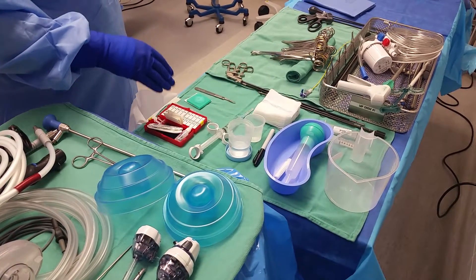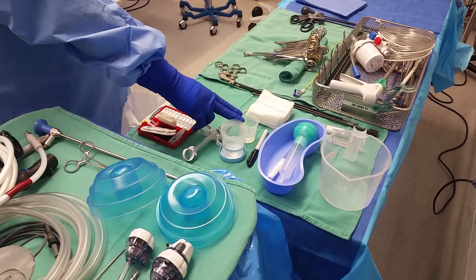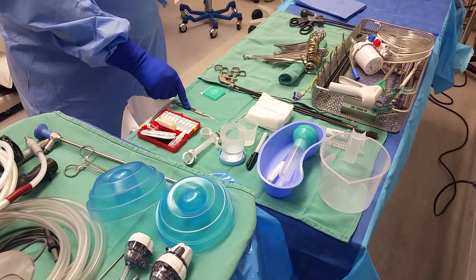Always important to have any kind of medications on your field labeled. Here, we have Isovue and a half-percent Marcaine. Always isolate your sharps and know where they are at all times. Here, I have my blade for incision.